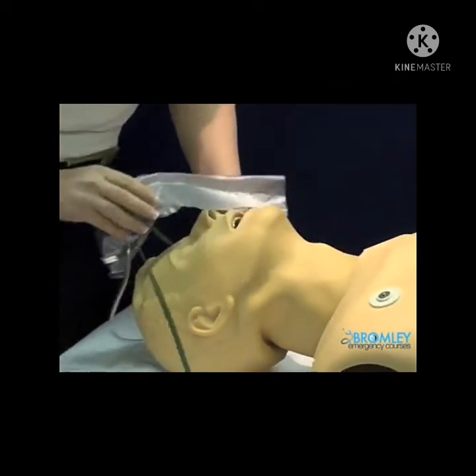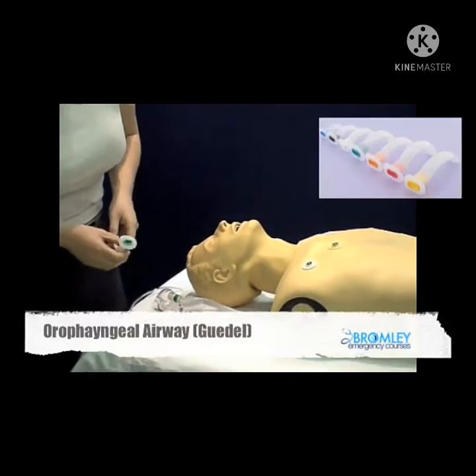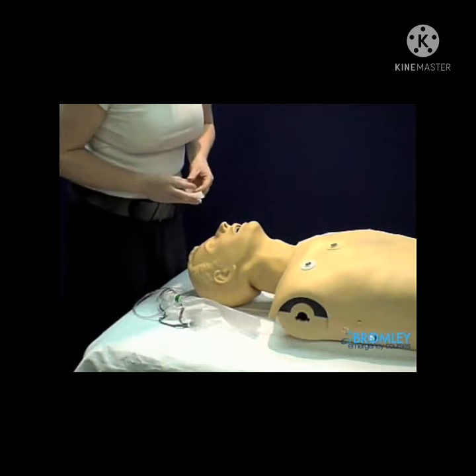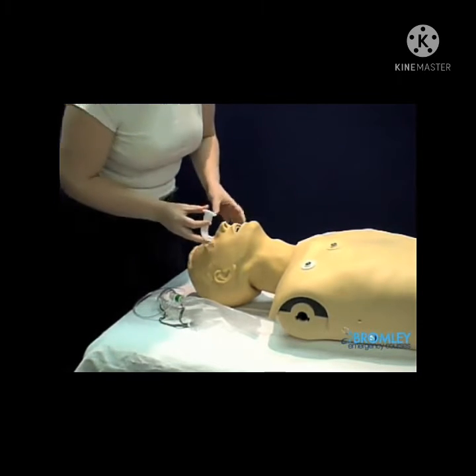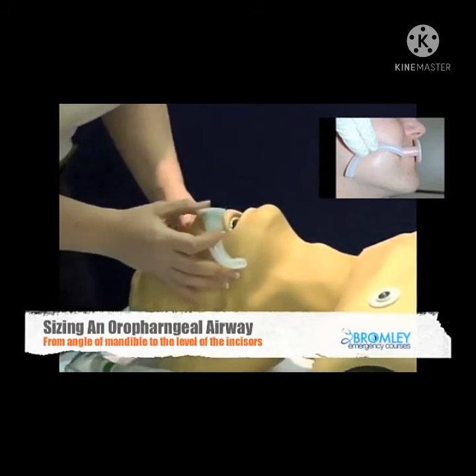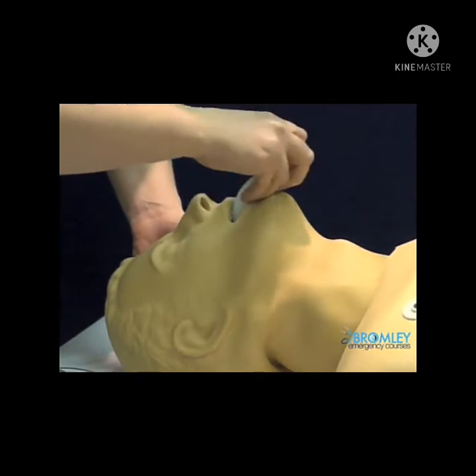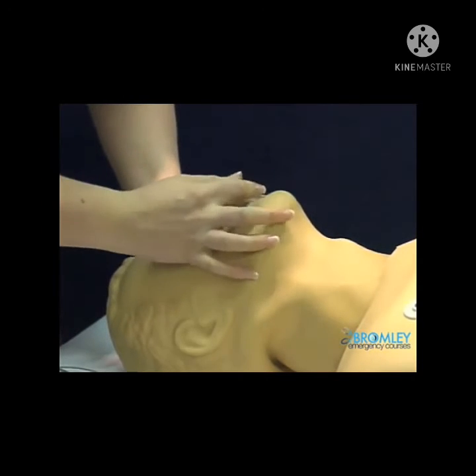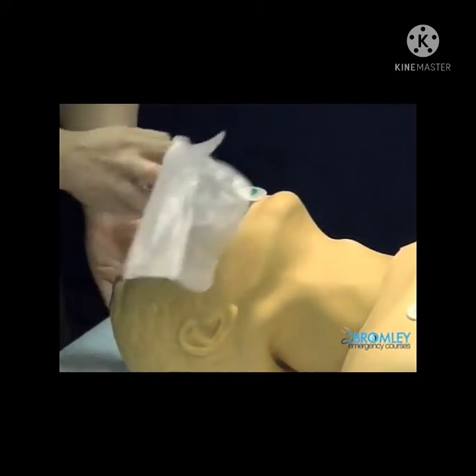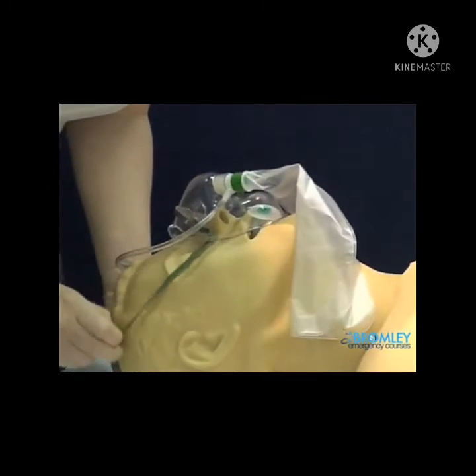So another option that we have is to use an adjunct such as a Goodell airway. And first of all we need to size this, and we'd size this the way that it sits, so from the incisors to the angle of the mandible, and you insert the airway backwards and then rotate it round. Okay, now that's worked. The noisy breathing has stopped. So for now we can reapply the oxygen mask.